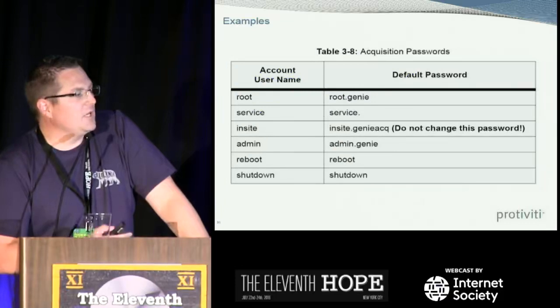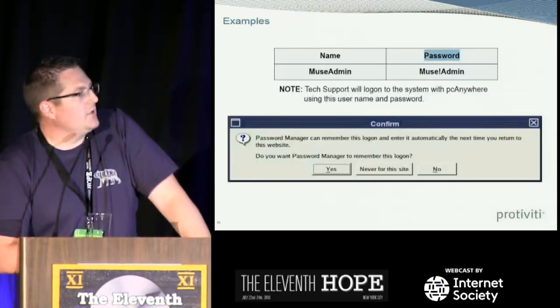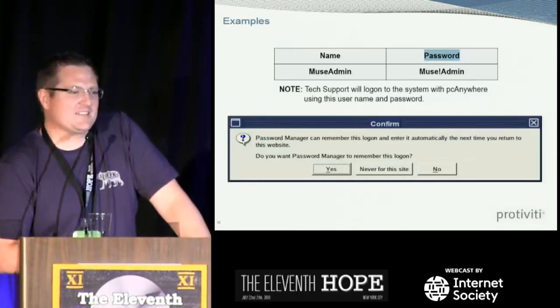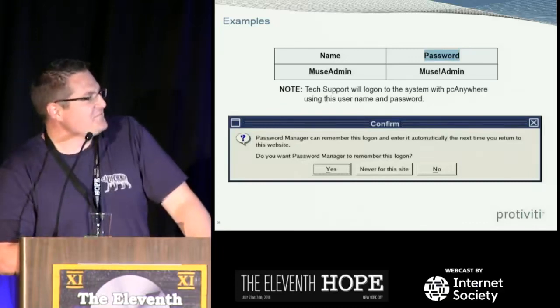Here's another one, again in big and bold, do not change this password. Another one, hey, tech support will log into your system with our backdoor account and use this username and password. And hey, doctor, I know you love remembering passwords, so just click yes and you won't have to ever enter it again.